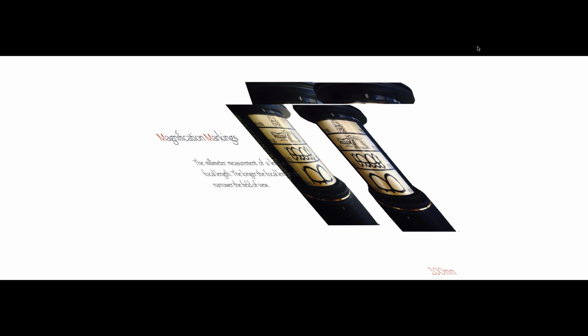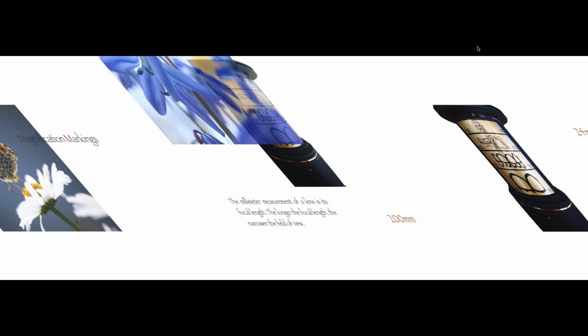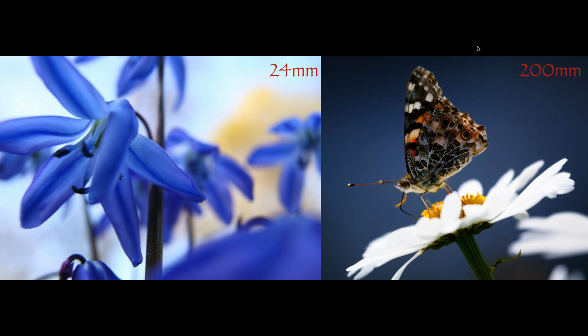So as you can see, the longer the focal length, the narrower the field of view. The closer I am to my subject, the least amount of structures that I'm going to get in my photo. That is basically what I'm trying to say here, and this is what I'm trying to explain here.